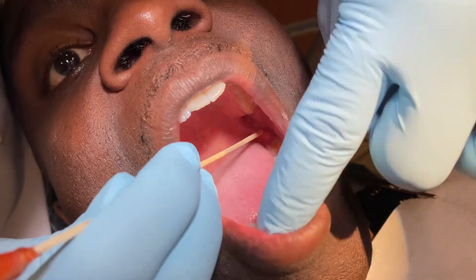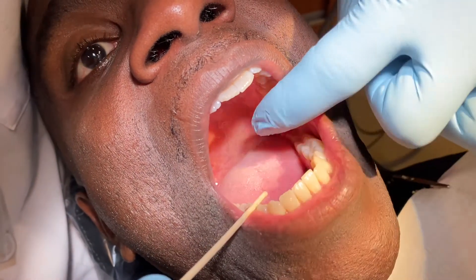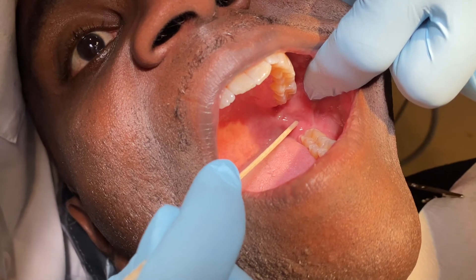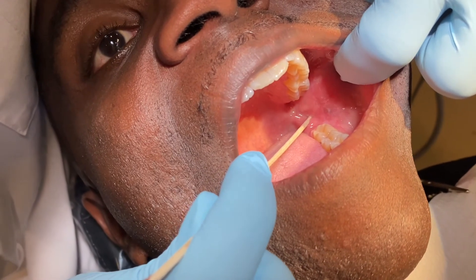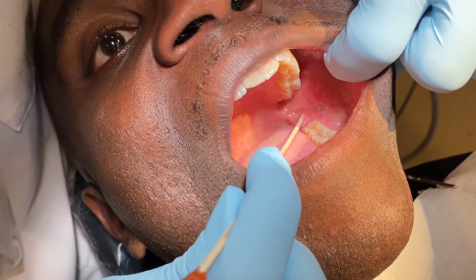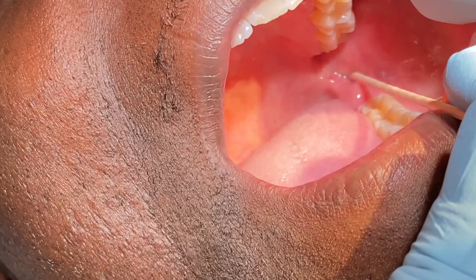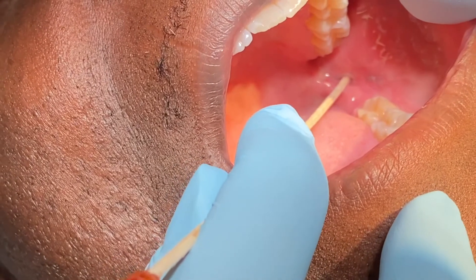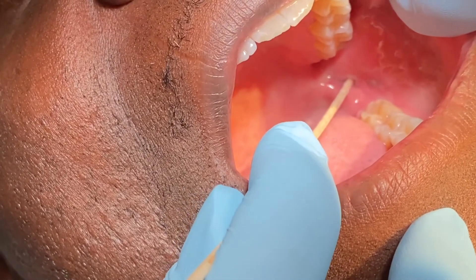When I go to inject for the inferior alveolar nerve block, I'm going to come in from the bicuspids on the contralateral side. My syringe is going to come in from the contralateral bicuspid side, and I'm going to aim right at the center of my triangle. I'll inject just superficially under the soft tissue — about a quarter carpule of anesthetic — then pull out just slightly, keeping the needle tip under the soft tissue. Then move to the ipsilateral side, advancing almost to the hub of the needle — within two to three millimeters — and then come back to the contralateral premolar side. Remember to aspirate before you infiltrate, then inject the remaining portion of the carpule.